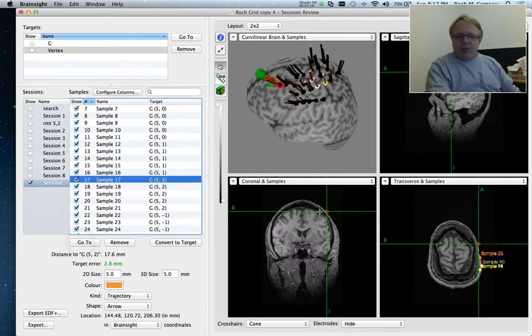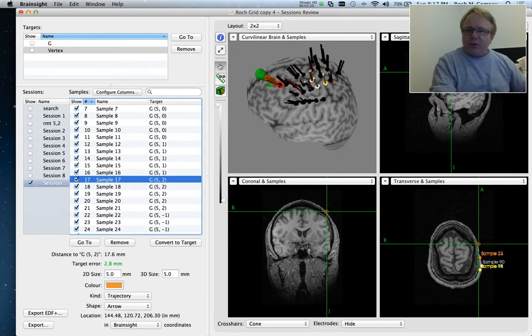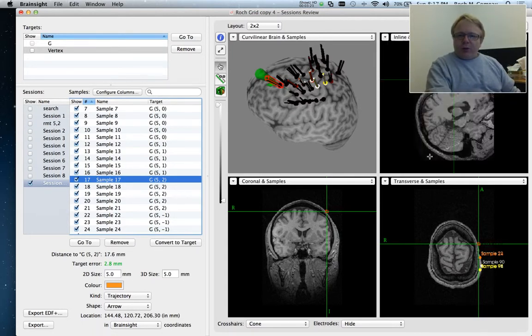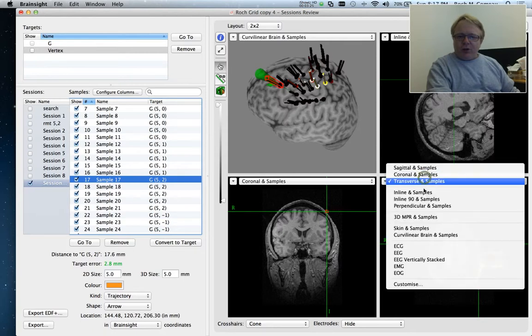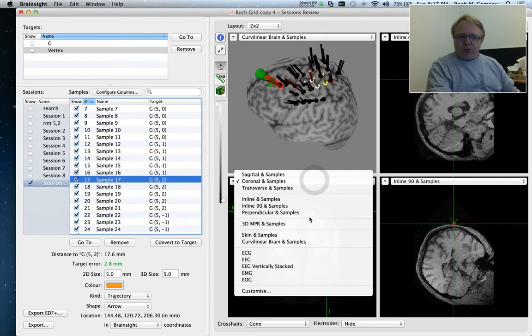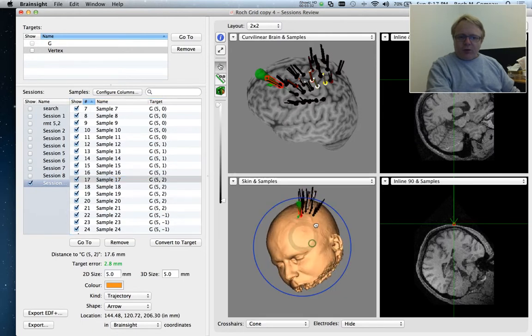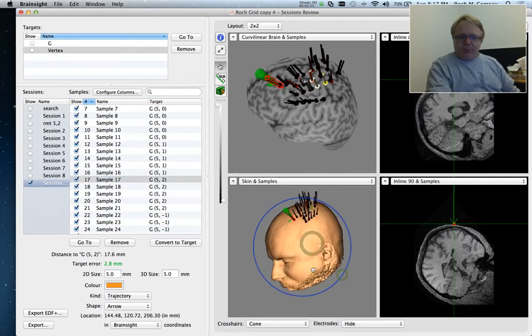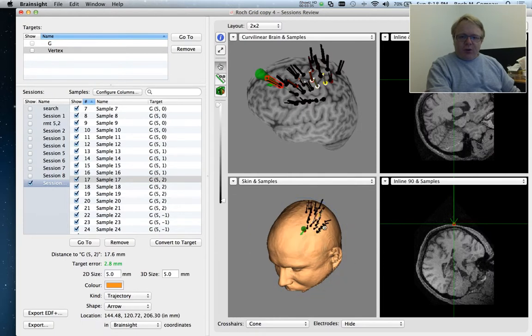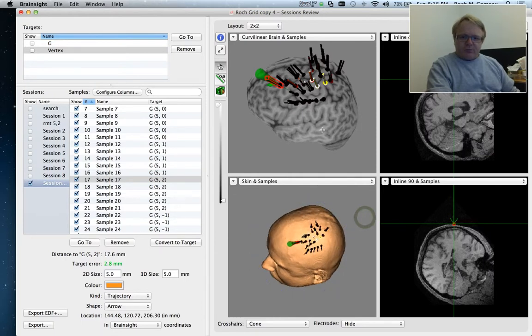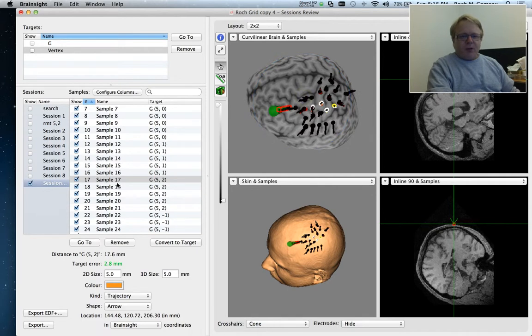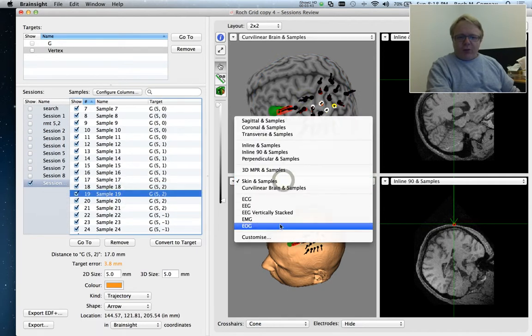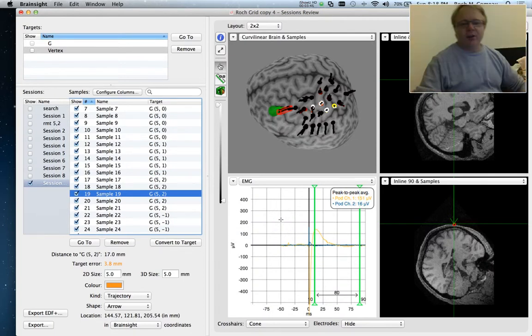And we can see exactly where the TMS coil was. And let me show that with some orientation information. So here's the inline and inline 90. And maybe I want to show a scalp just for reference here. So you can see here all the positions we've acquired some data. Now I can also instead select, for example, EMG since during this session we acquired EMG information. So here's our EMG display window.